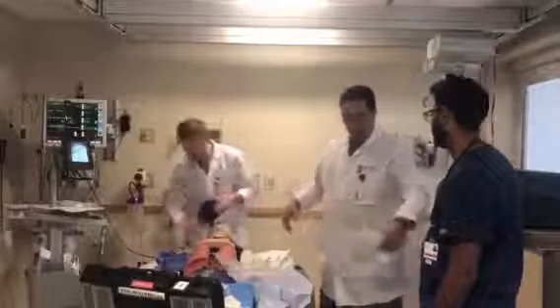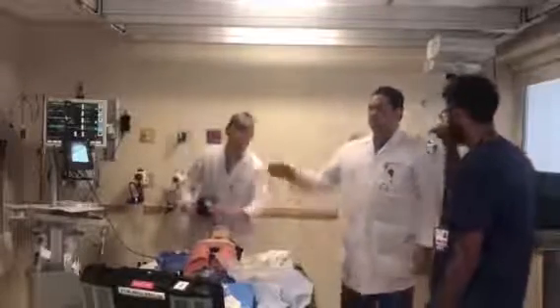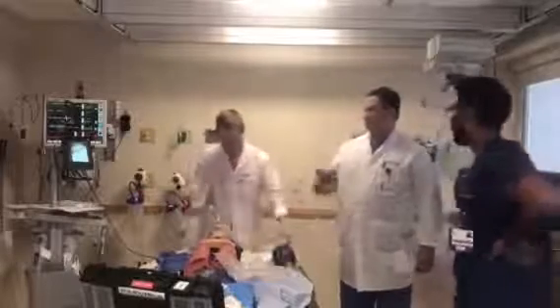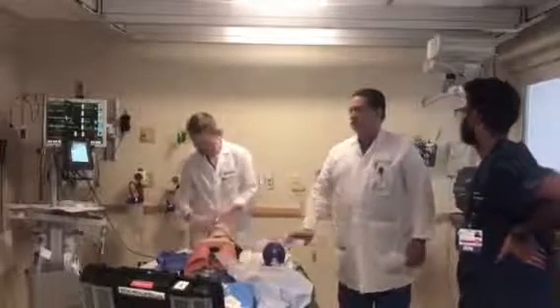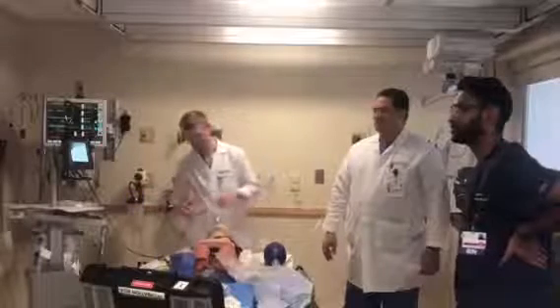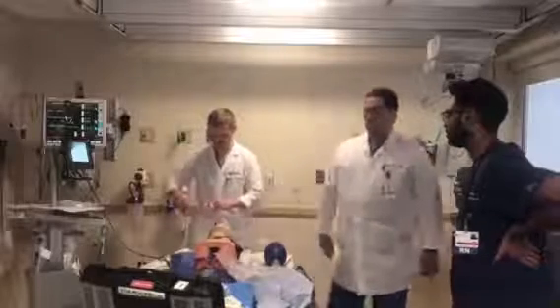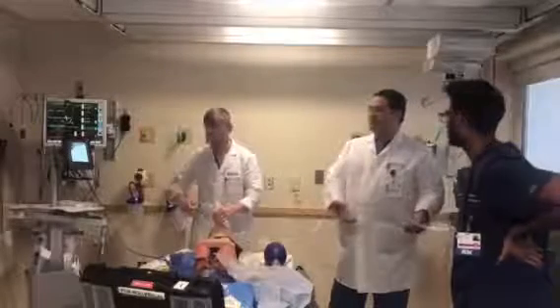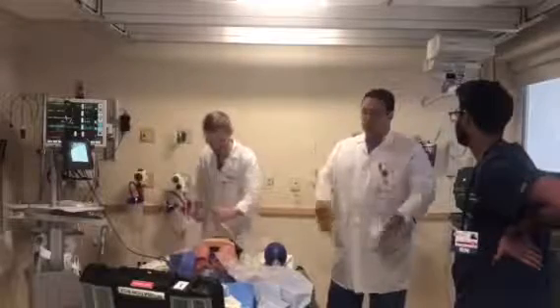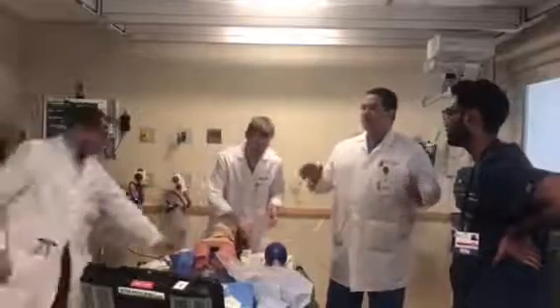So in the interest of time, done with that scenario, take everything out. This is not working. You put it in, it didn't work, what are we gonna do? What are you gonna do? No, not yet. Not yet. I mean, it must be malposition then. Well, it's not working. He pushed here and everything is not working. So what are we gonna do? The combi tube. You can't lose an airway in the presence of a combi tube in your hospital. That's it. The combi tube is made for paramedics.